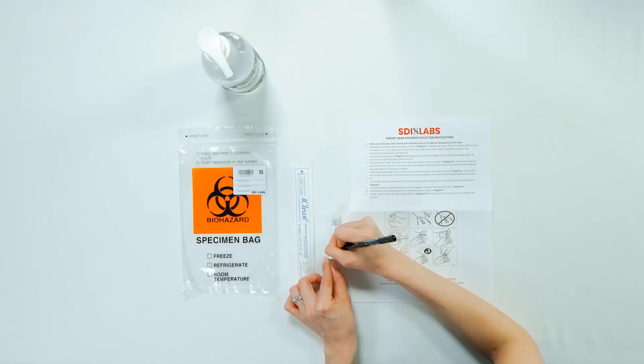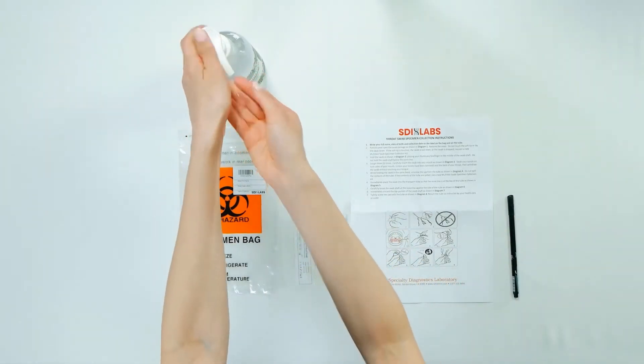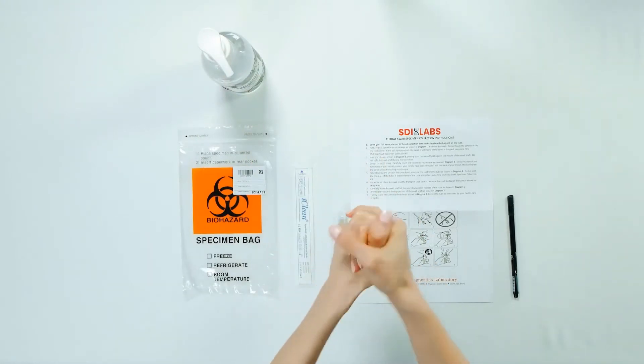Label your tube with your first and last name and date of birth. Before you give your sample, be sure to sanitize or thoroughly wash your hands.